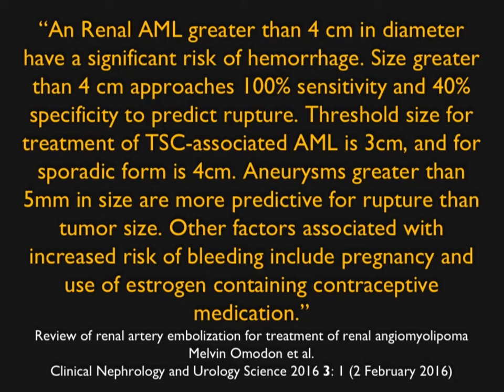Aneurysms over 5 millimeters are more predictive of rupture than tumor size. So again, you want to look at the aneurysms. It should also be noted there's an increased risk of bleeding in patients who are pregnant or taking estrogen-containing contraceptive medication. So that's something also good to keep in mind.